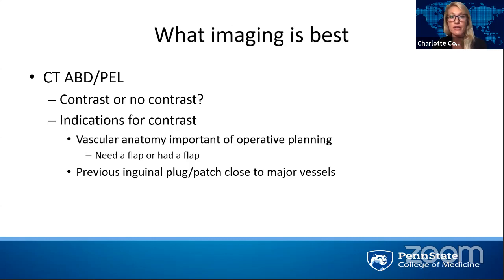Another reason to include some contrast in your CT scan is if you're thinking of removing any inguinal plugs or patches. Those can often be very, very close to the iliac vessels or the epigastric vessels, and appropriately counseling the patient on the risks of the procedure, as well as being prepared for those operations and how to proceed, contrast is definitely helpful in those situations.